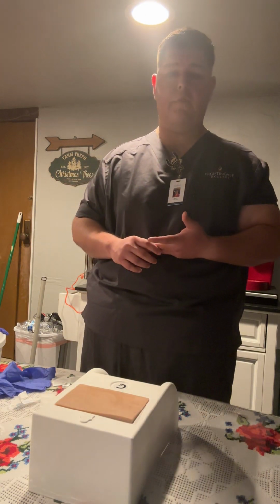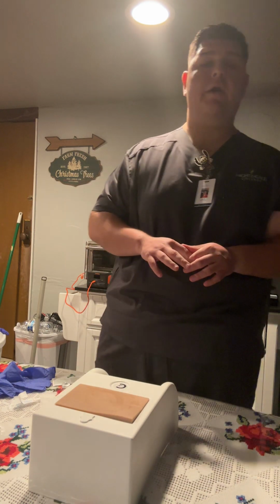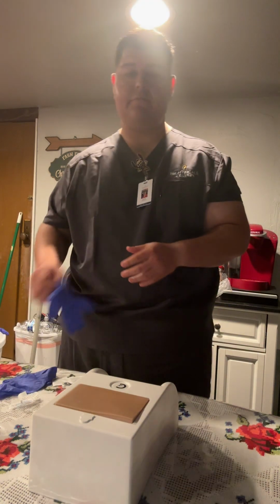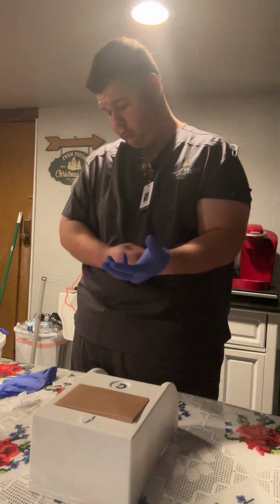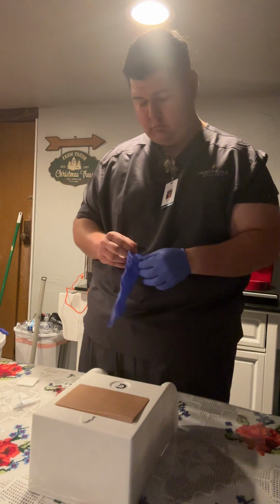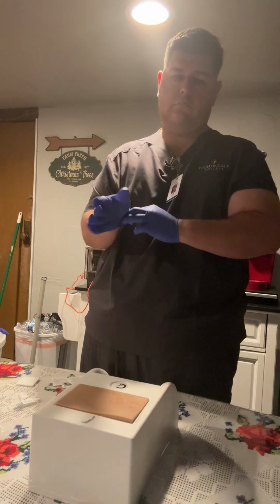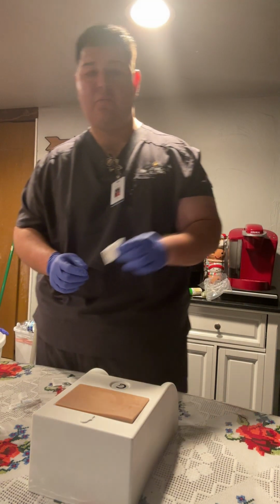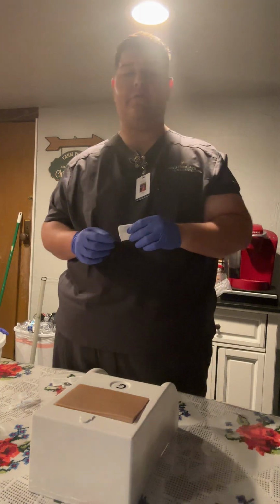No? Okay, thank you. All right, at this point, I would go back and verify the medication with the MAR, the third and final time. Once I'm done verifying, I will perform hand hygiene. Put on my gloves. At this point, I want to clean the top of the medication vial with the alcohol pads and dispose of them once I'm done.